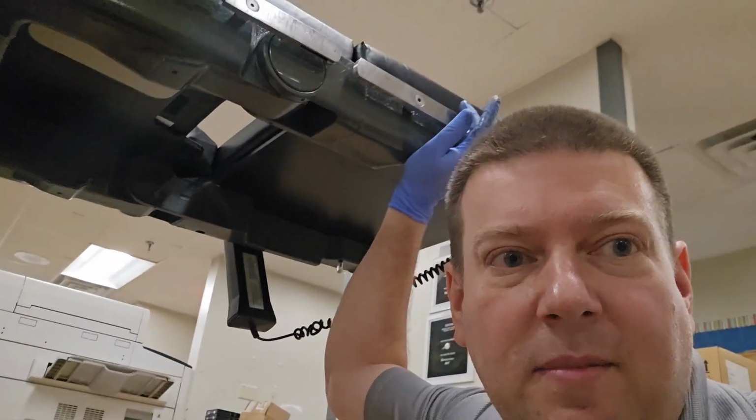Anyway, guys, I know that's a brief rundown on this table. My hands are covered in grease, so I'm limited on what I can show you, but it gives you an idea of what to deal with anytime you have a table that's wobbling too much.